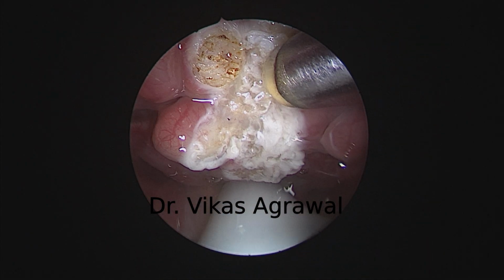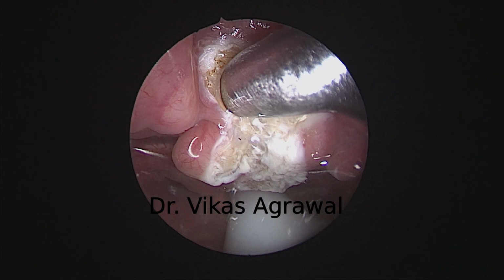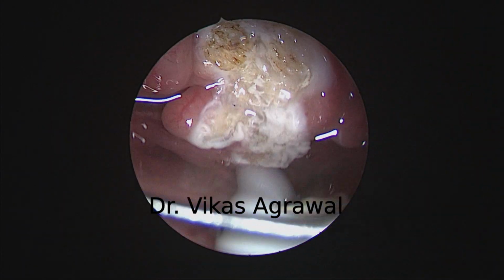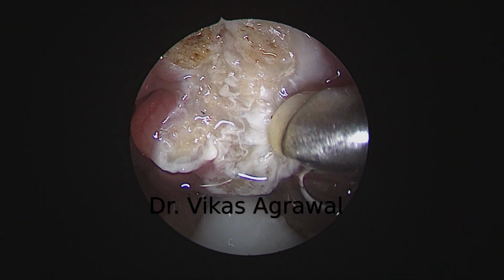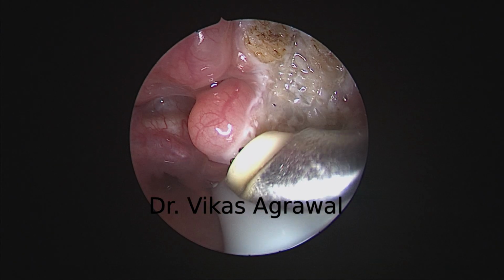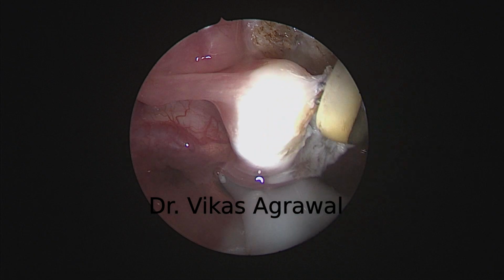But my main aim is to coagulate on the median glossoepiglottic ligament area. This is a large lymphoid tissue which I need to ablate, which I am ablating now.